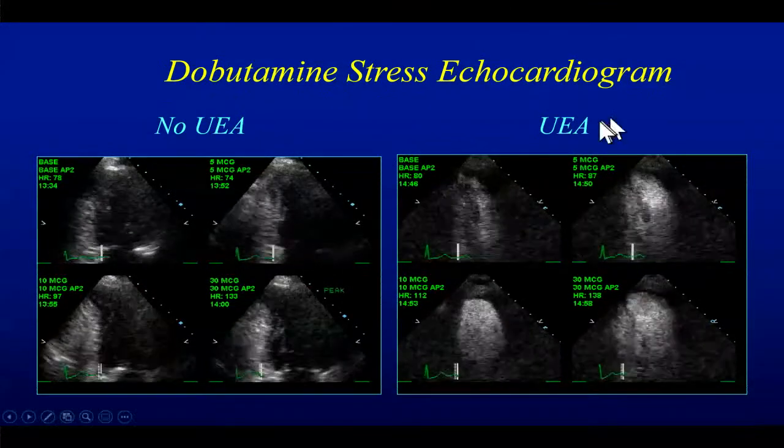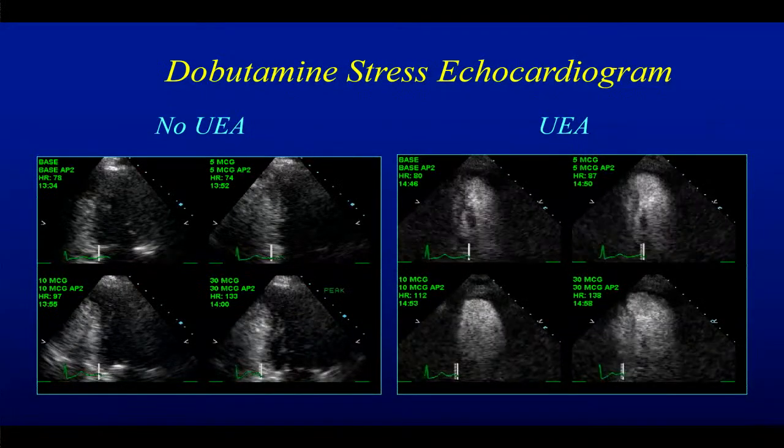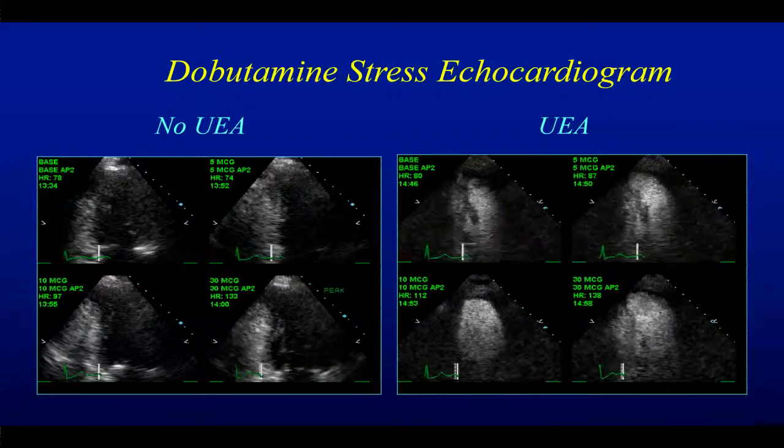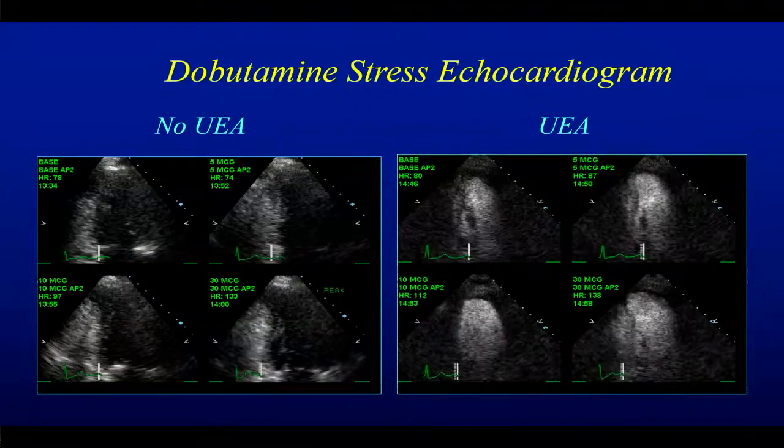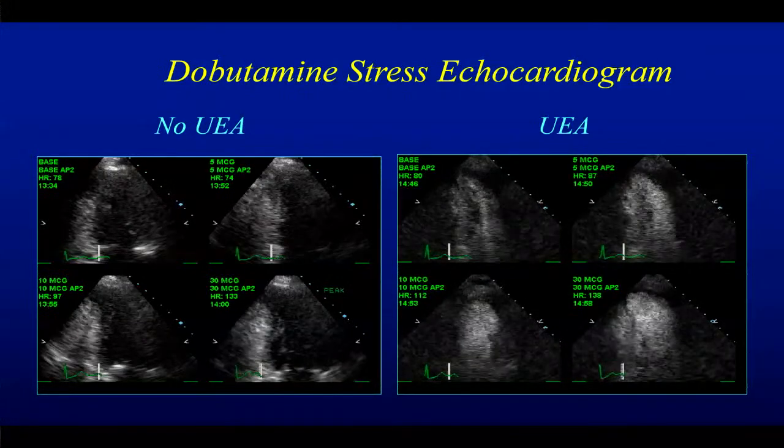So use it similar to what you would do for resting images. Keep in mind that your images, even with dobutamine, will become more challenging once you are on dobutamine, right?